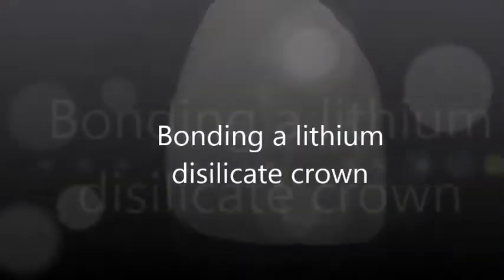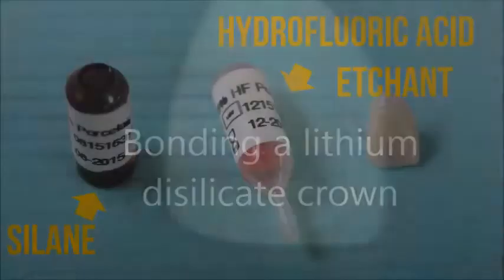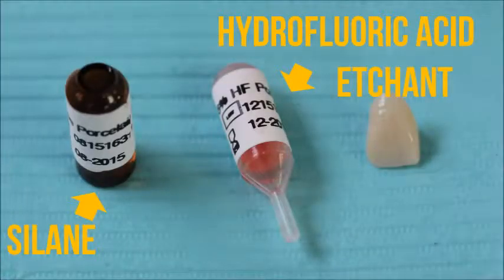Today we will learn how to bond a lithium disilicate crown. Our armamentarium for preparing the crown includes a silane primer and a hydrofluoric acid etchant.